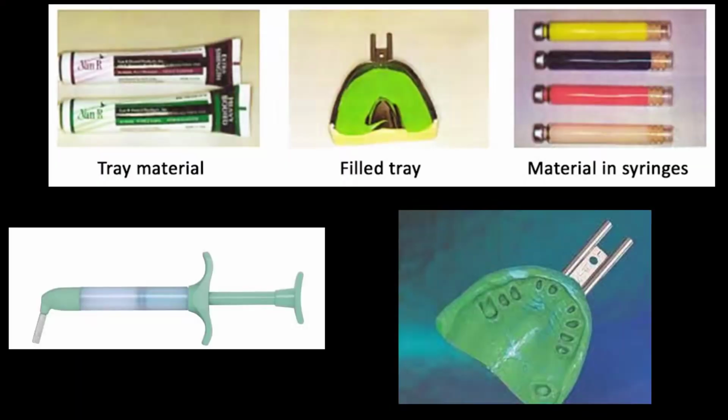These are the different consistencies of the agar impression material: the syringe consistency for injection onto the prepared surface, and also the tray consistency to be loaded onto the impression tray.